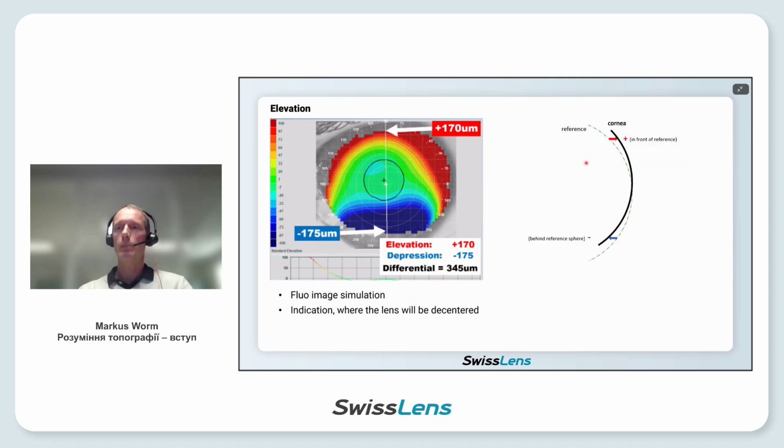Furthermore, this map can give you an information where the lens might later decenter to. Normally, a lens will drift to the negative part of the elevation map, the one that is behind the reference sphere. So in this case, there might be a tendency of the lens to decenter downward.